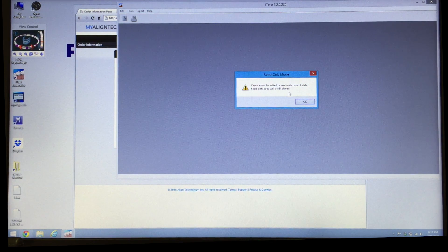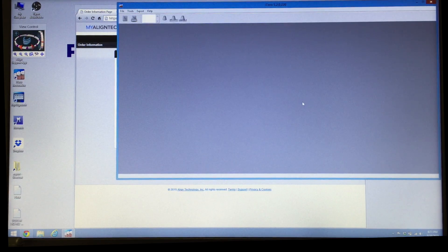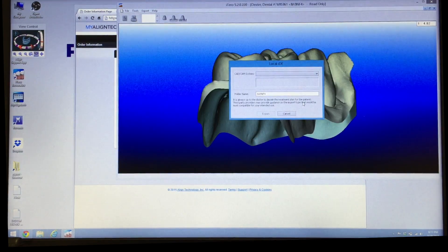It's going to say the case cannot be edited or sent in its current state — a read only copy will be displayed. That is correct, that's fine. We don't need to change that; in fact, that's what we do want.